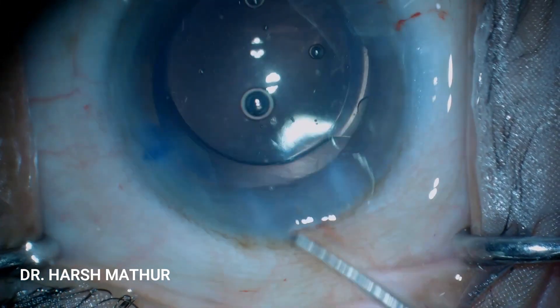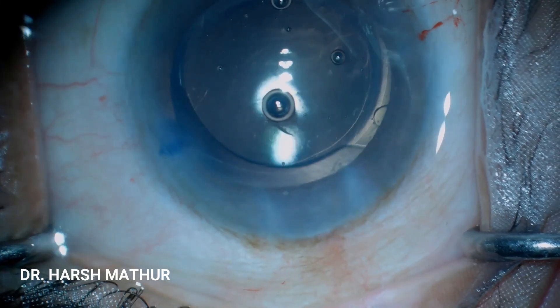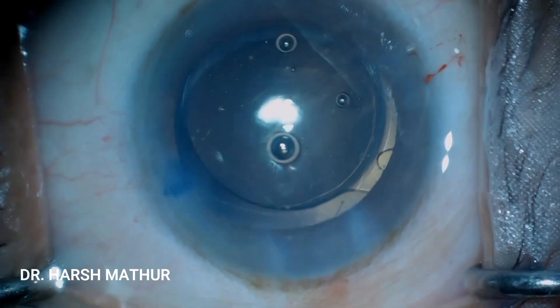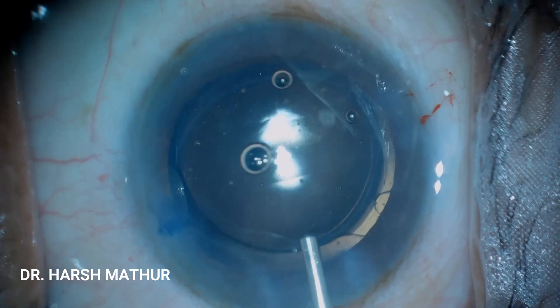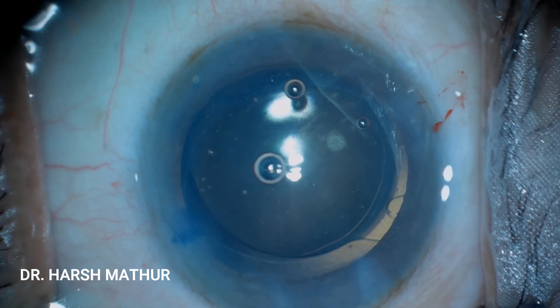The lens has been placed in the bag and the chamber is again filled with viscoelastic substance. Now to perform the opposite clear corneal incision.